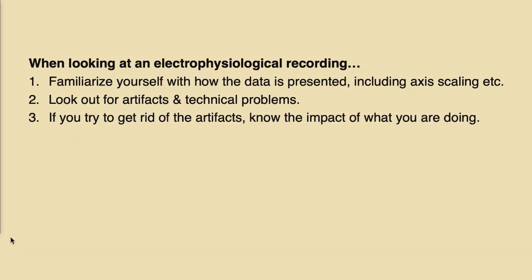Sometimes one can try to get rid of artifacts using additional analysis options. Or you could export the data and manipulate it yourself with MATLAB or R or Python or whatever. But of course, you need to know what you're doing and how this impacts the data, because whatever you do with your data, you usually don't just remove artifacts and signs of technical problems.